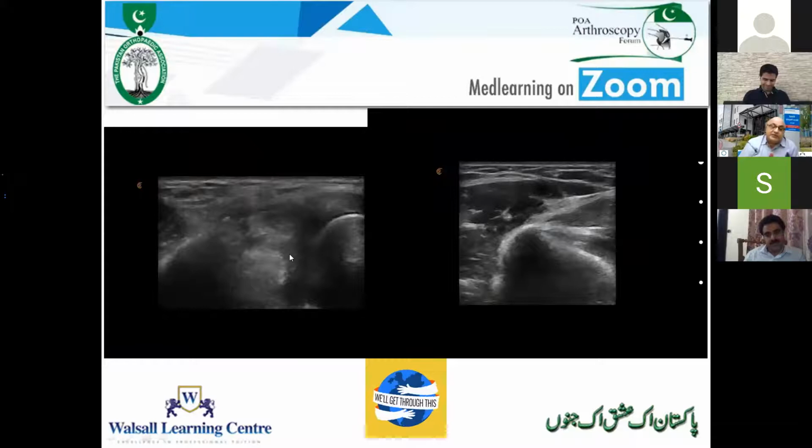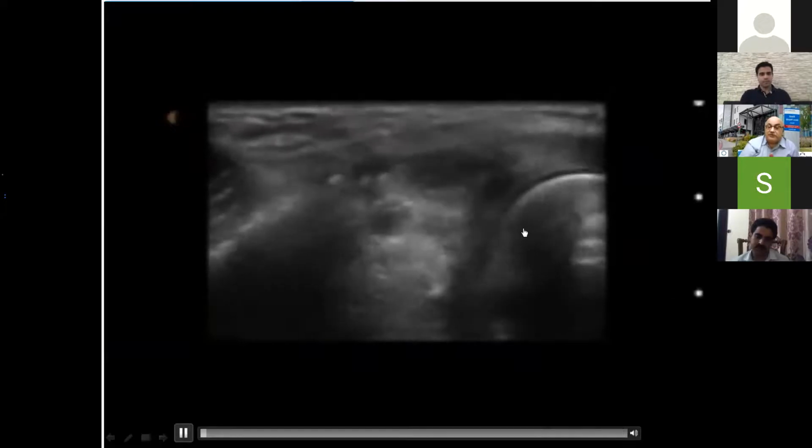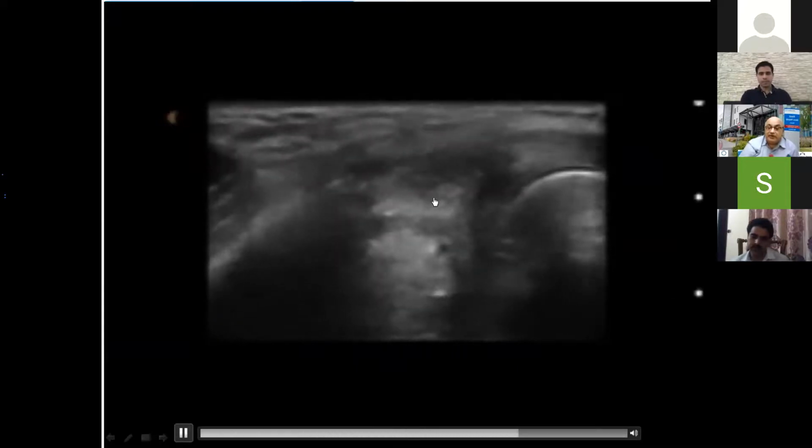One of my patients was told that you can only have ultrasound guided tennis elbow injections. So this is PRP into the elbow. This is the radial head, epicondyle. And this is the sac after we filled PRP into the bursa, or the remnant of the bursa of the tendon, under the tendon. This is a dynamic ultrasound, so you can actually see the radial nerve move and you know where everything is.